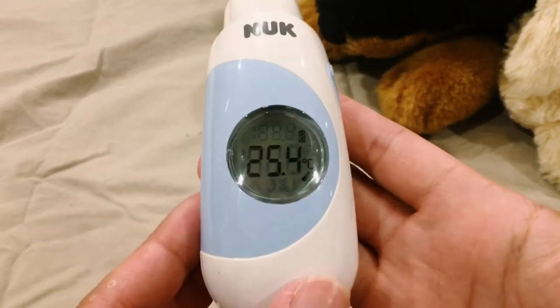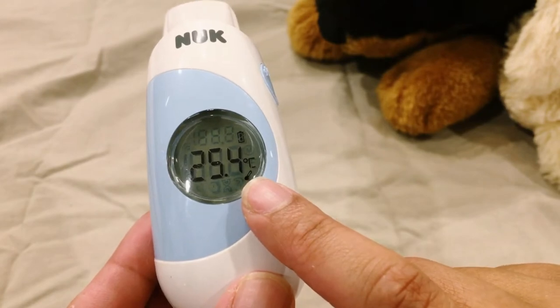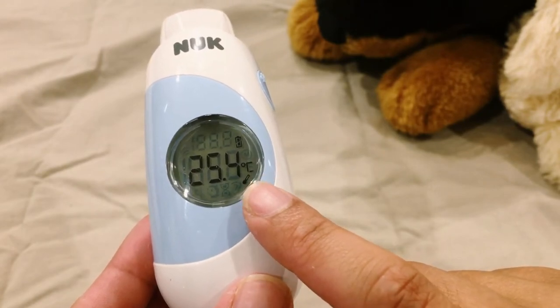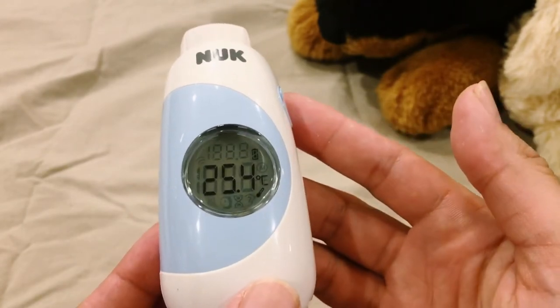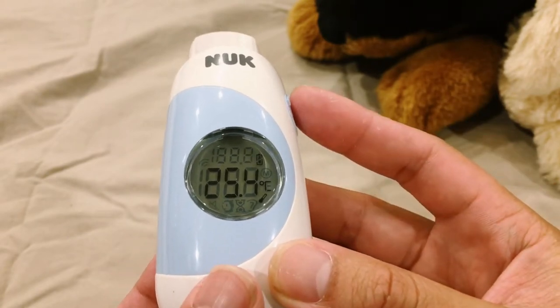If the thermometer is not operated for around 1 minute, the device automatically switches to room temperature mode. As you can see, the room temperature is 25.4 degrees Celsius now.